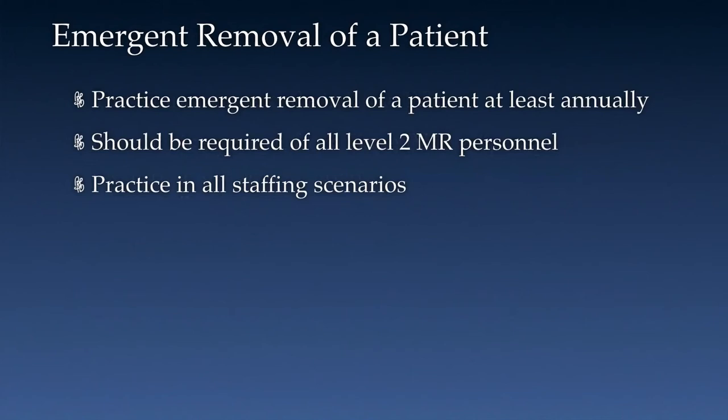It is critical to practice the emergent removal of a patient from Zone 4 at least annually. This should be required of all Level 2 MR personnel. Additionally, this should be practiced in all possible staffing scenarios. If you haven't done this lately, perhaps this week is a good time to do so.